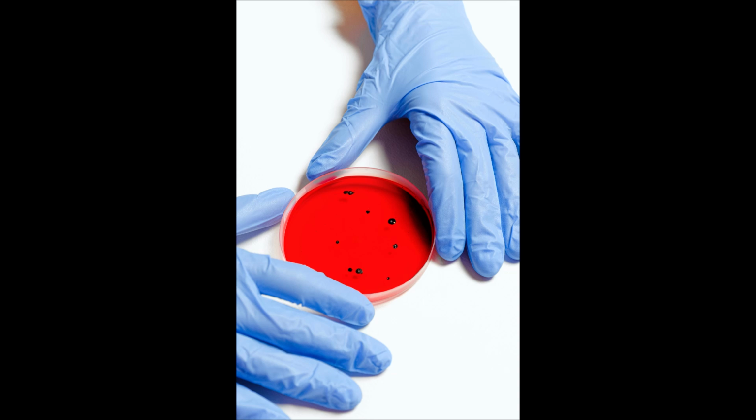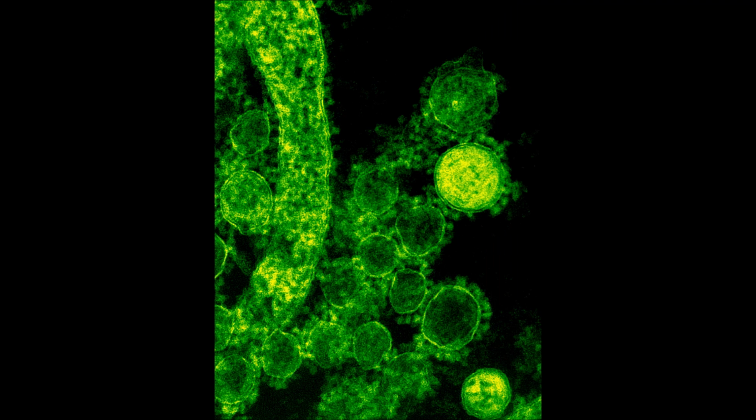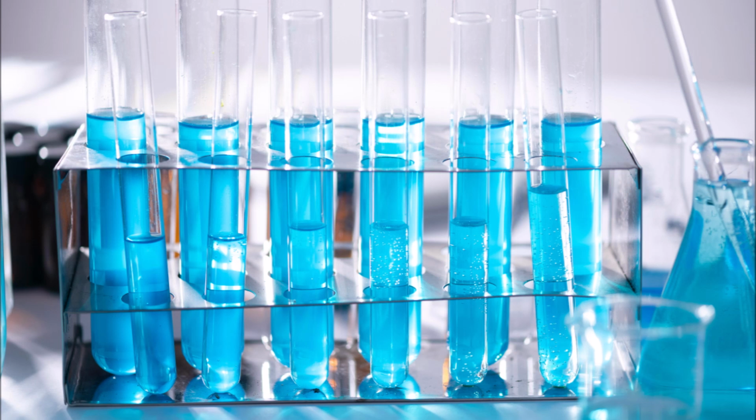Another thing that is also used now is magnetic-activated cell sorting, called MACS. It uses magnetic beads to isolate target microbes from a population. The beads are coated with specific ligands that are expected from the microorganism. So when the medium is passed through, the microorganism is able to attach to the beads that it runs through.